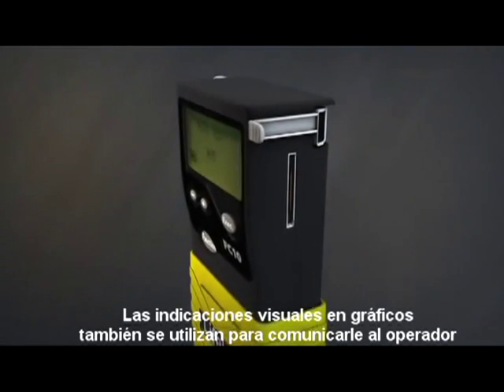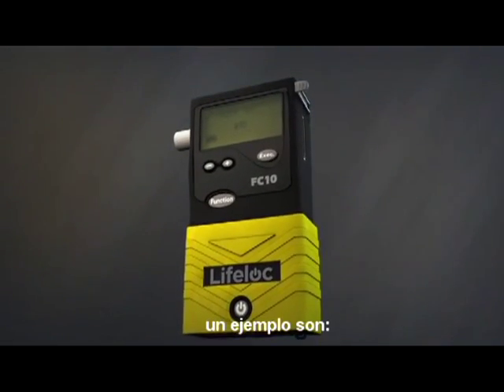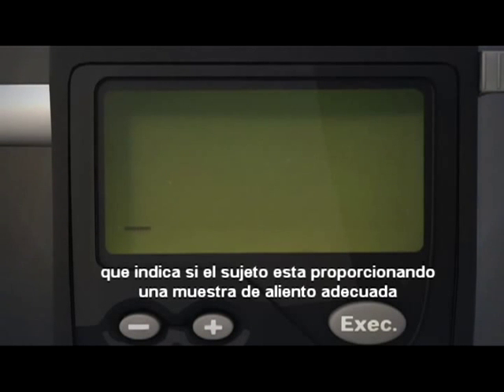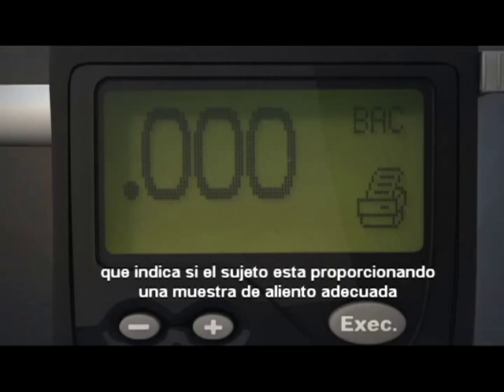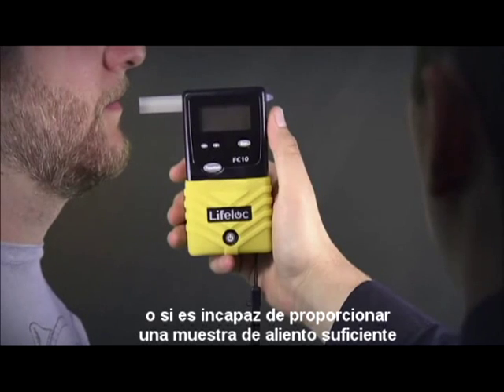Visual cues and graphs are also used to communicate with the operator to ensure proper testing. An example is LifeLock's unique breath flow graph, which indicates whether the subject is providing a proper breath sample, is being uncooperative, or is incapable of providing sufficient breath.